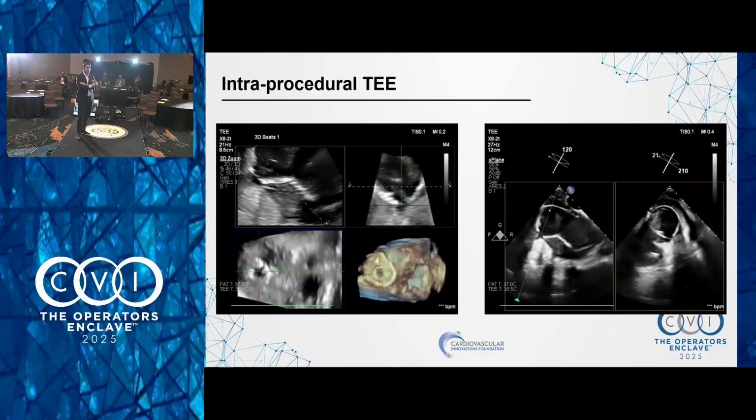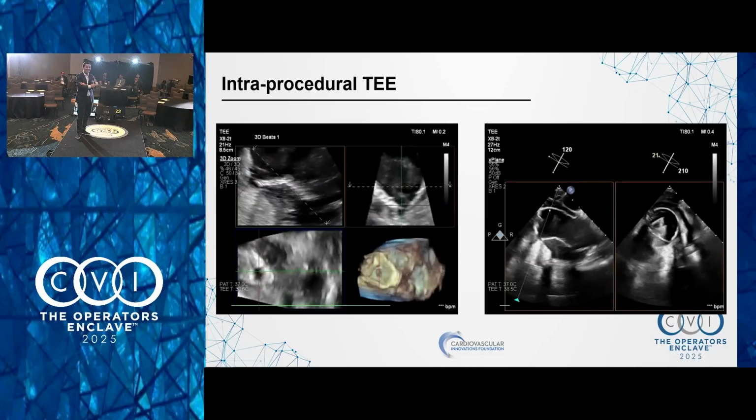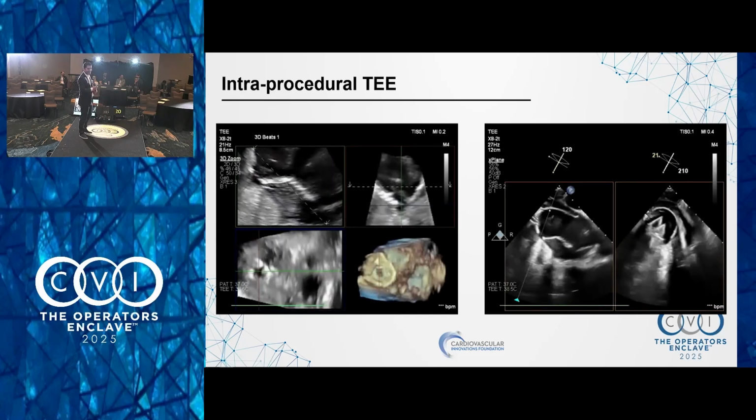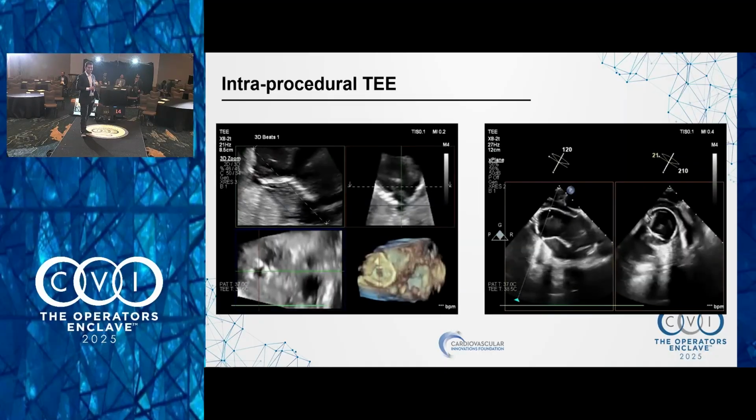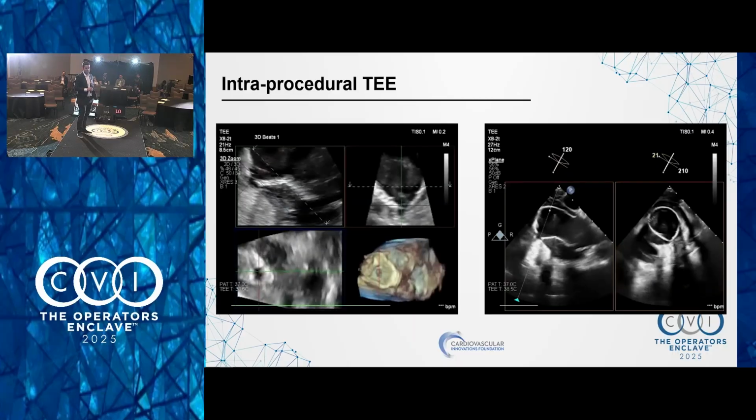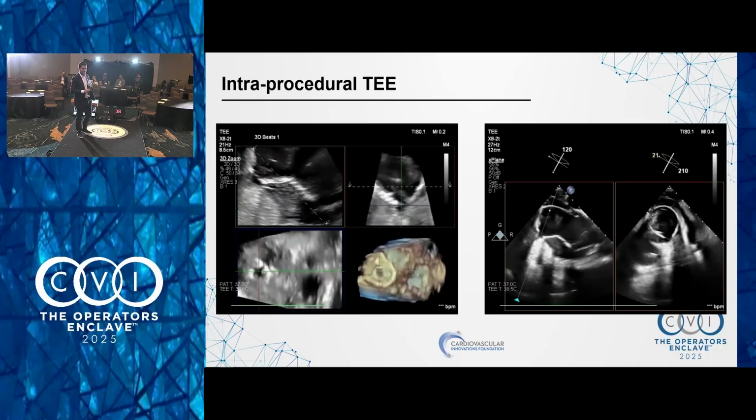Very good. So which one would you... a covered stent in the right? I'm just in that mood right now. Yeah, well, you used up all the covered stents in your last case, so I don't know. But you know what I mean? I think that unless you perfectly seal that entry of the pseudo, the right coronary perfusion may still leak. It's a great thought because they share ostia, and we don't want flow through a stent into that PSA.